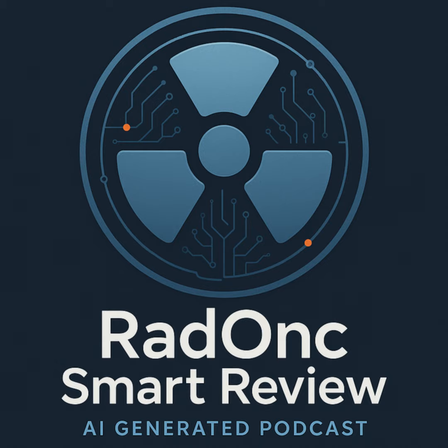Bremsstrahlung. Sounds German. It is German. It means braking radiation. Braking radiation. Okay, that sounds descriptive. It really is. Imagine one of those high-speed electrons coming from the cathode, entering the tungsten target, and flying near an atomic nucleus. Not hitting it, but getting close. Okay, close to the positive nucleus. And the nucleus has that strong positive charge, while our electron is negative. So there's a strong pull. An electrostatic attraction, right.